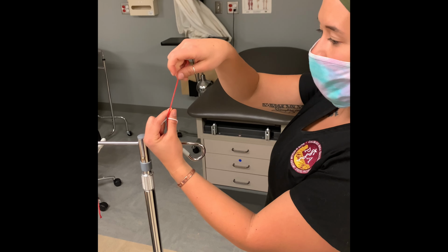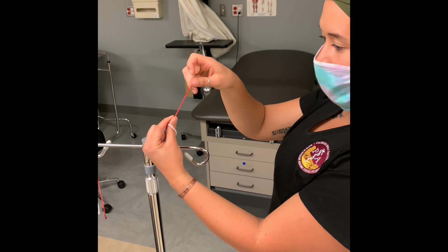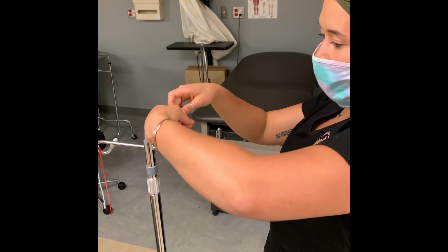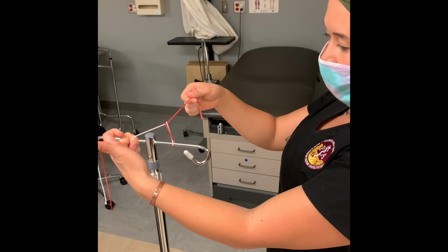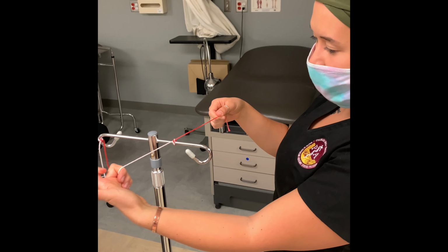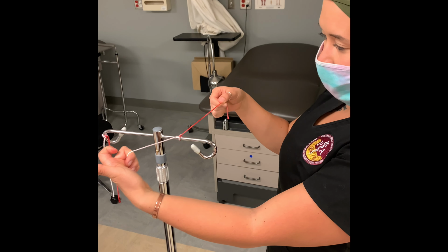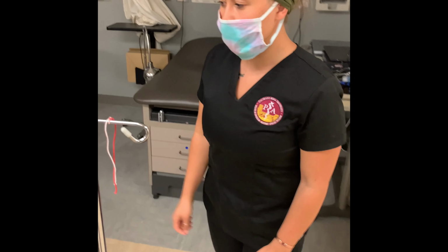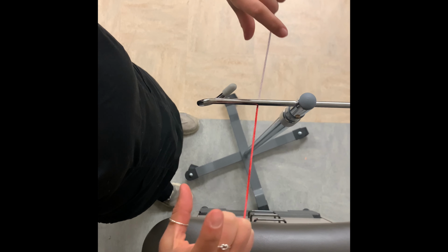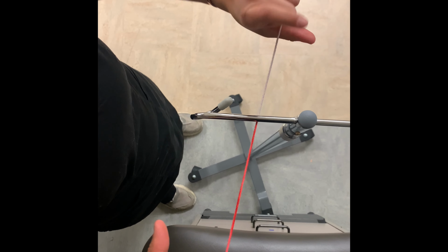With your right hand, feed the right suture towards the left thumb and index finger. Pivot left wrist downward and through the loop. Grab the right suture with the right hand and tie the knot down. Note here that you do not have to cross your hands to lay it down flat. To close the knot, alternate between throw 1 and throw 2. And remember to practice. Here's a demonstration of the double-handed knot tie from a downward angle.